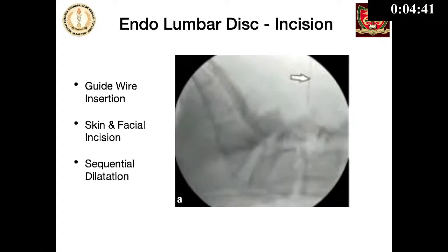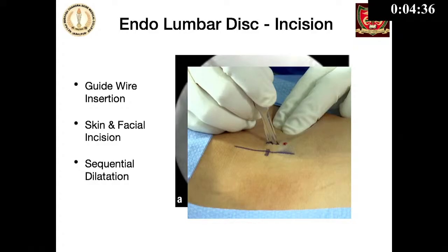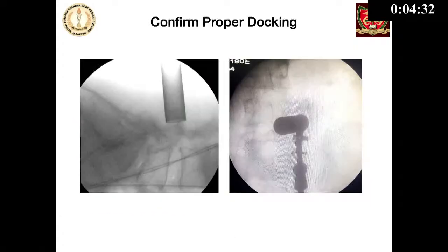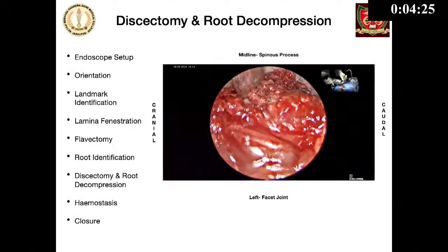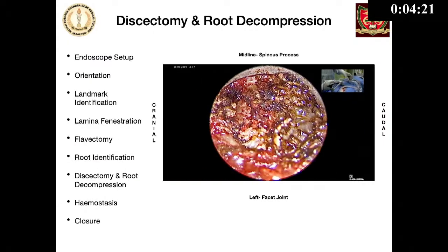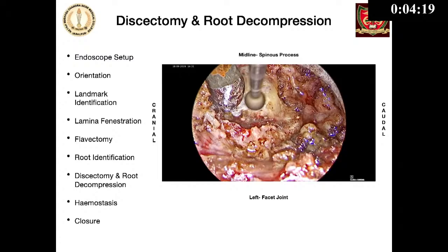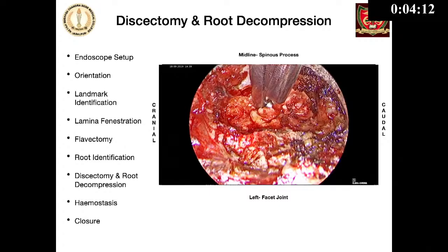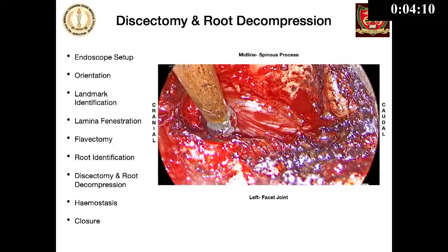So we have learned from our experience, using these tubes from lumbar to craniovertebral junction, started from simple cases to complex cases and different types of pathology. Lumbar disc is simple and ideal to start. It is done in the prone position with this special localizer, and then we confirm the level. Just a finger-breadth incision. And then again confirm, because docking is very important to confirm in AP and lateral view.